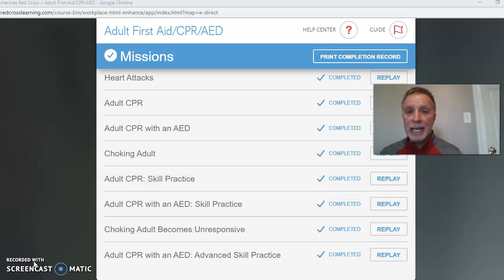One nice thing about an AED, say if you've never seen one, if you get the opportunity on Stevenson campus, down by the gymnasium on the left side, when you walk down the steps, there's an AED in the encasement on the wall. But that being said, it prompts you. So it's pretty simple to follow.